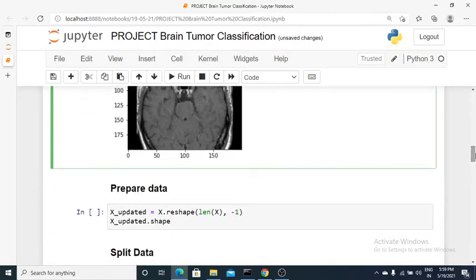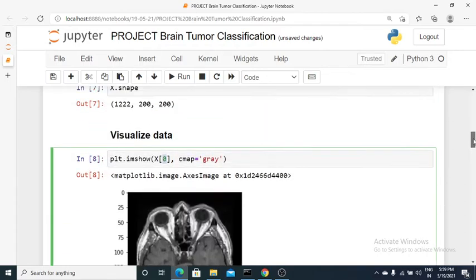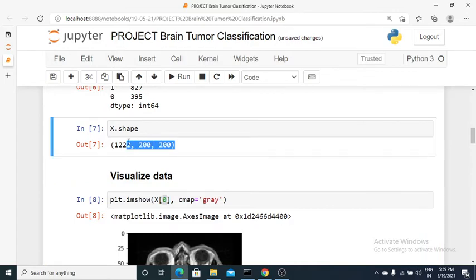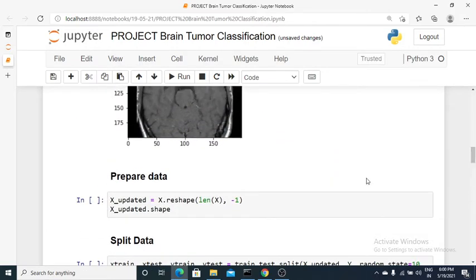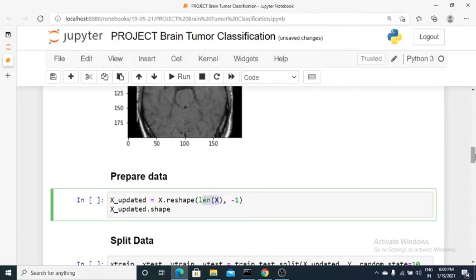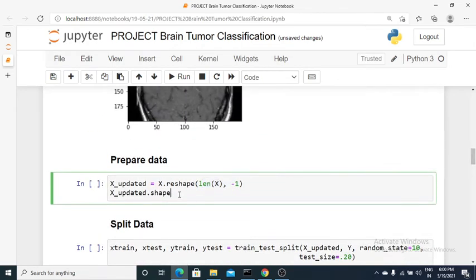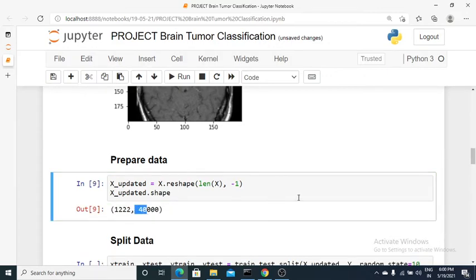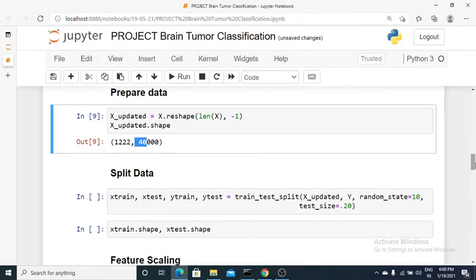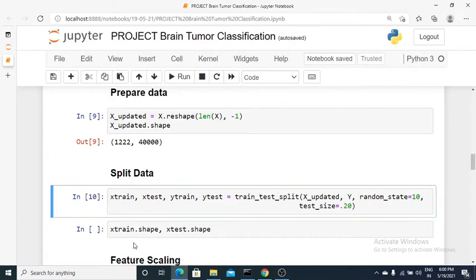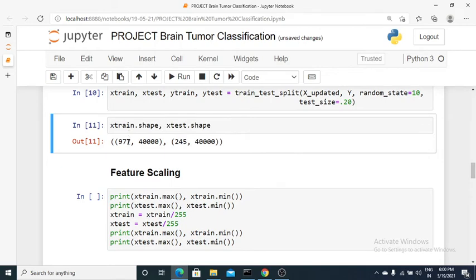Sklearn works on two-dimensional data only, but our data has three dimensions, so we need to flatten each image. Each image is 200 by 200, giving 40,000 features per sample. I've used reshape with the number of rows as length of X (1,222) and minus one for columns, which auto-calculates to 40,000. I then use train_test_split with 20% for testing and 80% for training — resulting in 977 training samples and 245 test samples.